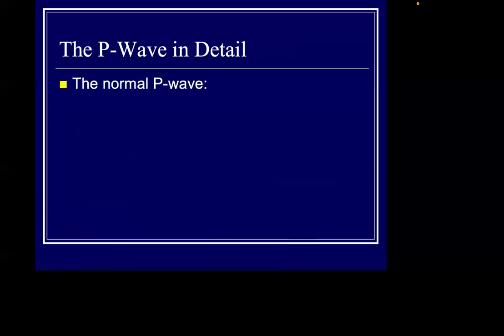So if we come to the abnormalities of the P wave, it is very important in the ECG rhythm and should be assessed every time you look at the ECG. First, you have to assess the P wave. Is there any P wave? And if the P wave is there, is it normal or not normal? You look for the contour, for the shape, for the amplitude, for the duration of the P wave. Everything in this is very important. You have to ask yourself questions. Question number one, is there a P wave in the ECG? Yes, there is a P wave. Does it have a smooth contour?